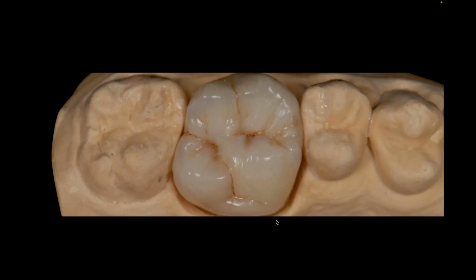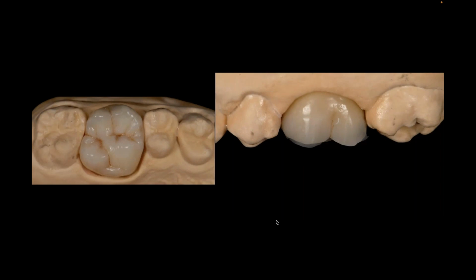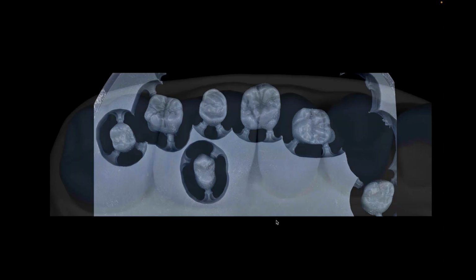But I want to be honest and real in the sense that things are changing, and maybe people sitting there with a brush and powders isn't going to happen as much as it used to, because the world has changed, and now I can mill those molars. I can go into my library and my CAD CAM machine, put a design in, put it into the model and make it look right, and actually start utilizing that. But there are some challenges there, right?